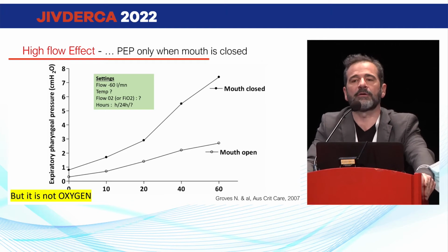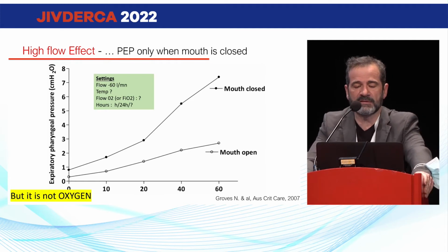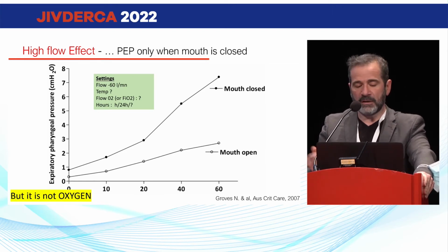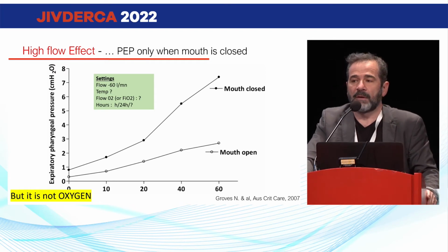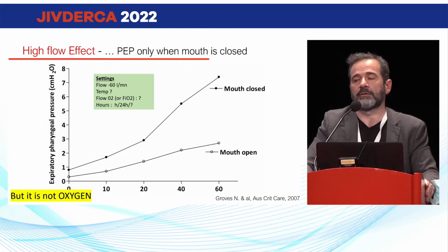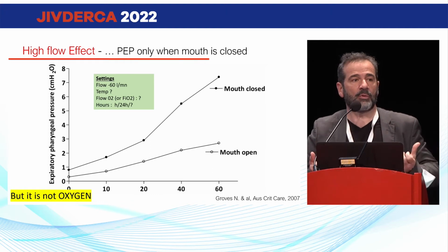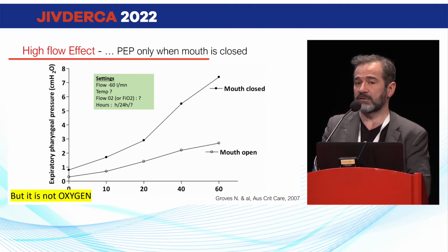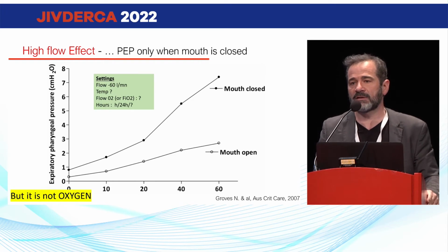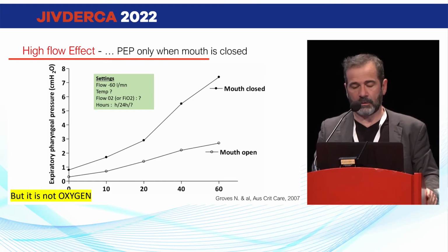And let's go to the effect on COPD patients, and this very interesting effect that you decrease the work of breathing, and I am completely convinced that it's due to a PEP effect. In this study, when they look at the high flow without oxygen, and it was not clear if it was warm or with high temperature, it was not in the methodology, you see that you produce expiratory pressure in your patients, and we know that in COPD patients it decreases the work of breathing, CPAP decreases the work of breathing in COPD patients, and you lose this effect if you open the mouth, like the bench I showed you before, because probably you lose the CPAP effect.